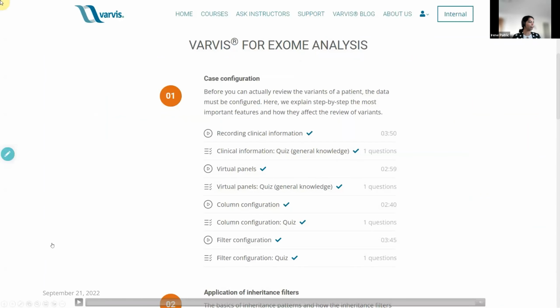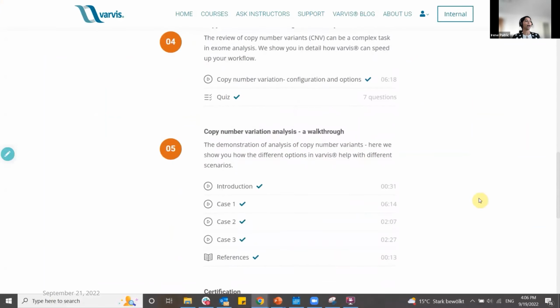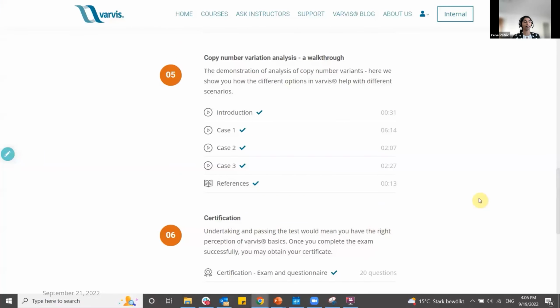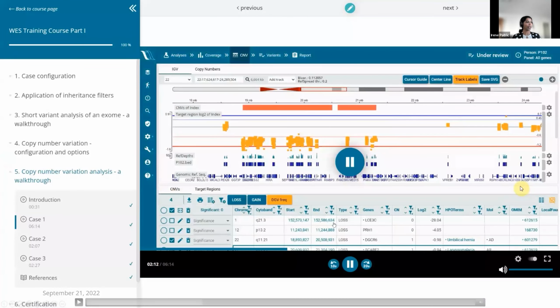This is just an example that I have given here of how the course looks. The courses have sections, as you can see over here, and several real-time cases have been explained. As you can see here, there is also a CNV case being explained in this video.